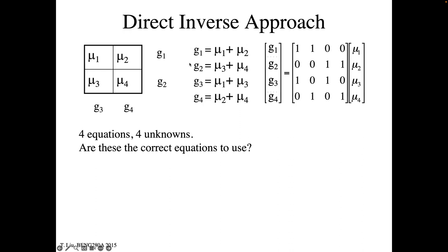So here I've got a set of equations now. I have measured these. I want to know these. So I have four measurements, four unknowns, and four equations. So by algebra, we should be able to just invert this. Those of you who have taken linear algebra have done a bazillion of these, where you create this matrix, and this is your A matrix, and this is your input here and your output. We have these, we're solving for these. So you should be able to invert that.